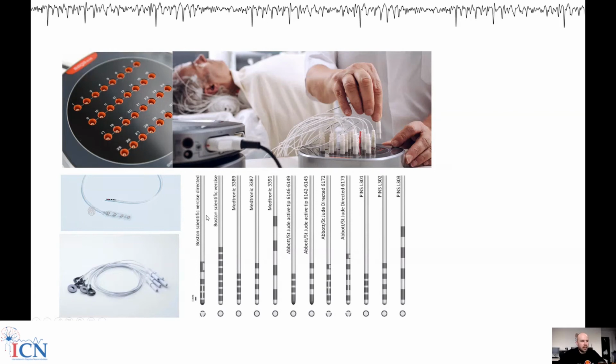So every tiny movement of this cable can be seen in these small contact recordings, because the signal we record is so low in amplitude that everything else really stands out. So I would say that overall, these directional leads did not help LFP research a lot. Instead, they made it more difficult.